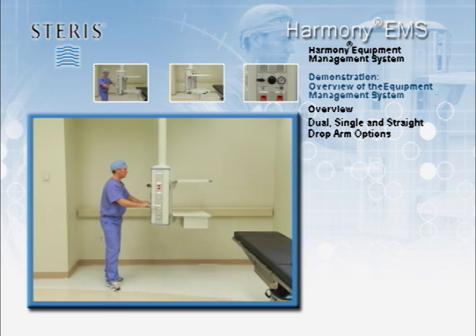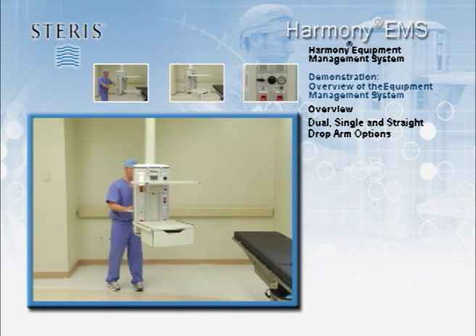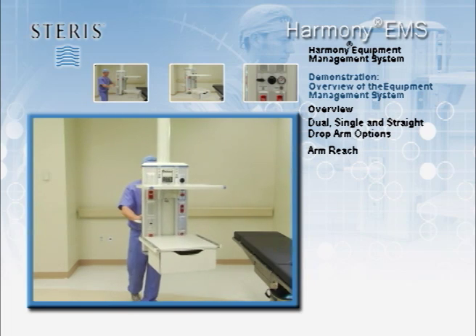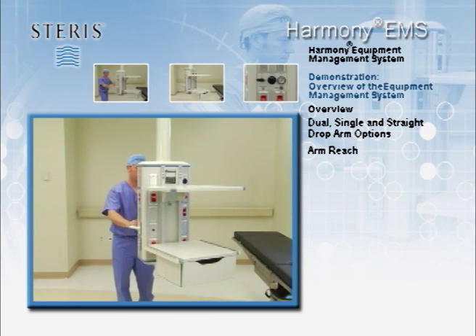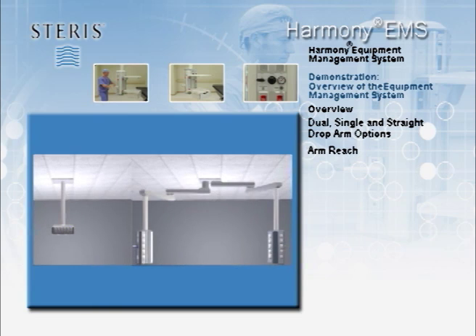This particular unit is configured with dual fixed arms for maximum positioning reach and flexibility. Dual fixed arms can reach up to 100 inches for complete patient head to foot or shoulder to shoulder coverage. Other options include height adjustable suspensions, single arm configurations or a straight down ceiling system that can be used when there is limited space or limited positioning needs.